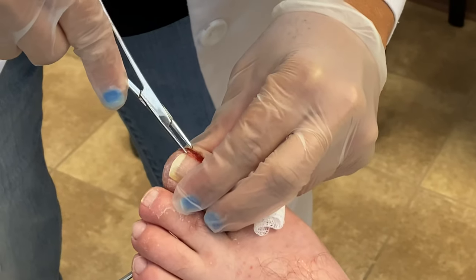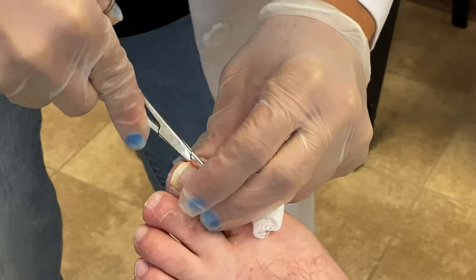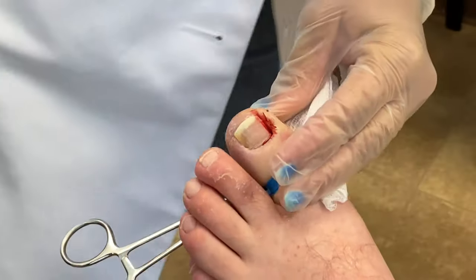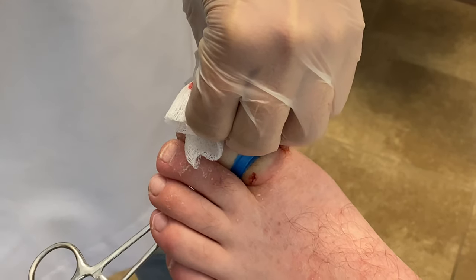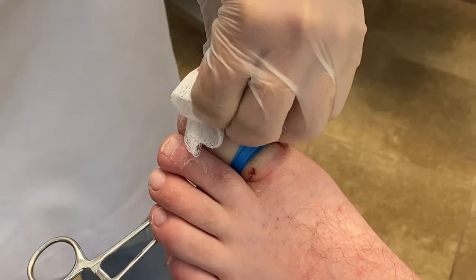Here we are about to remove the nail border in total. That allows us to get the offending edge out of the side of the nail.